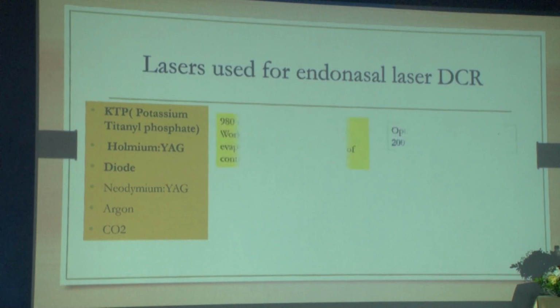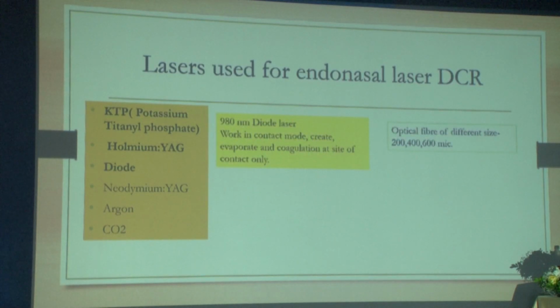The diode laser works in contact mode, and it vaporizes and coagulates only at the site of contact.